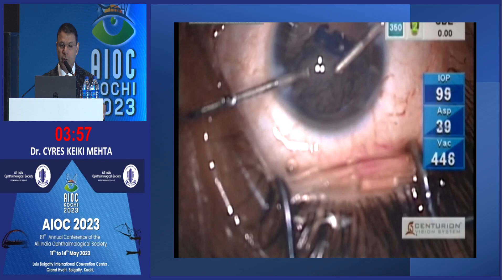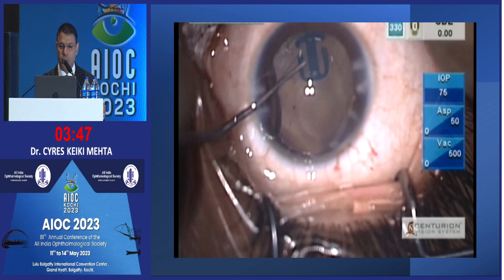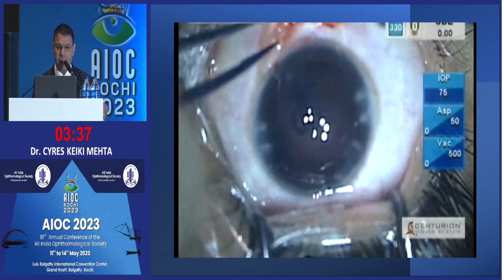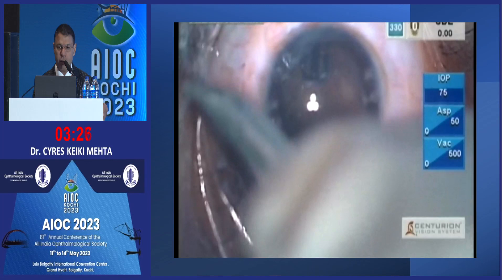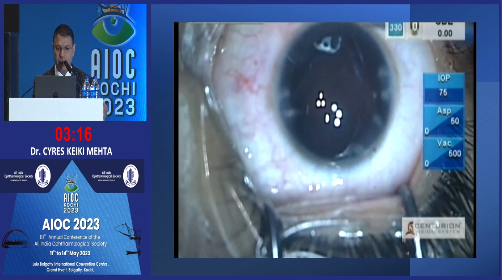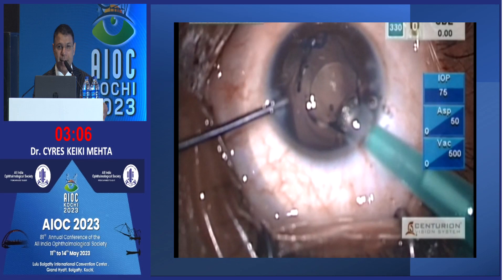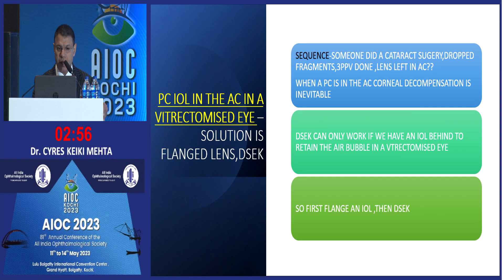Railroad the suture out of the eye and keep your anchor in there to give some stability in case the capsular bag looks like it is going to fold over once you take out the cortex. Luckily this didn't happen and the capsular bag was quite stable. After doing the eye, I pull the anchor with its two trailing legs which have enmeshed themselves in the periphery, then pass the suture twice through the sclera to lock it. You pass one suture after tying it and pass it twice through the sclera. Now you have generated a decent usable capsular bag and you can put your IOL in — just inject it carefully, otherwise it will jump open and hit the anchor.